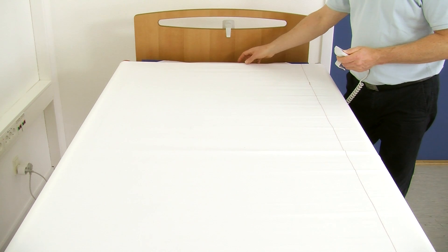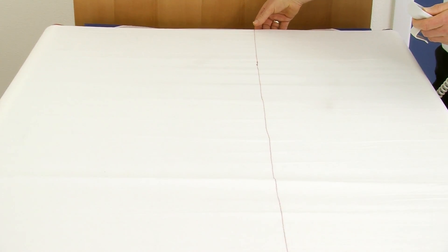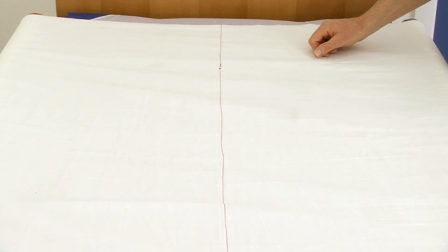Then pull back the turning sheet on the other bar until the red stripe is placed on the middle of the mattress. Slacken the turning sheet on both sides.